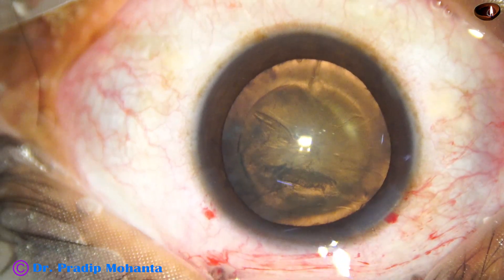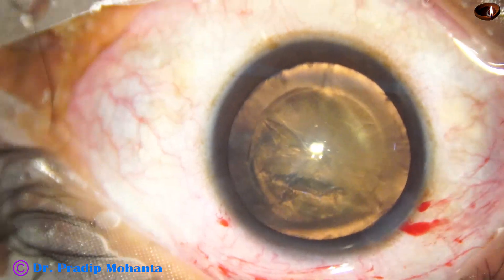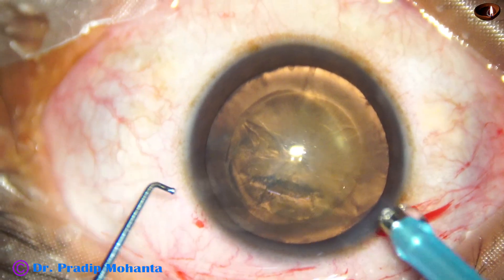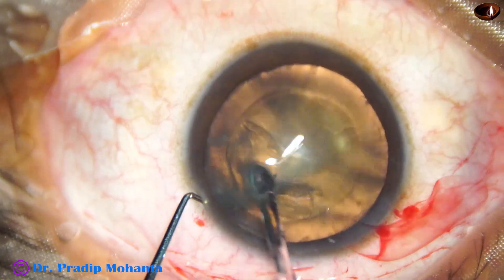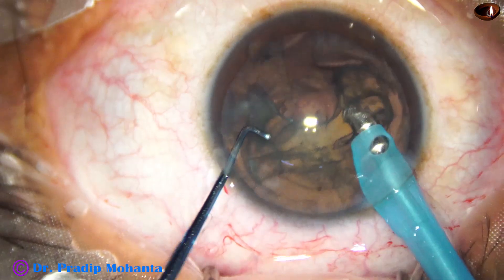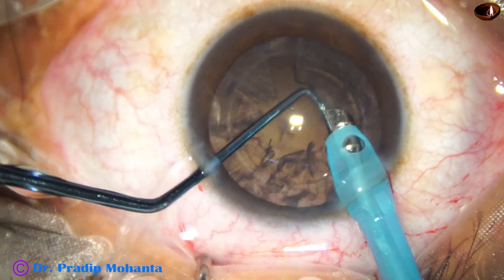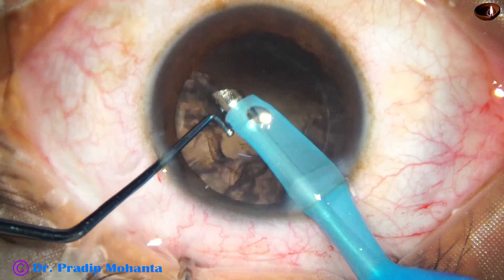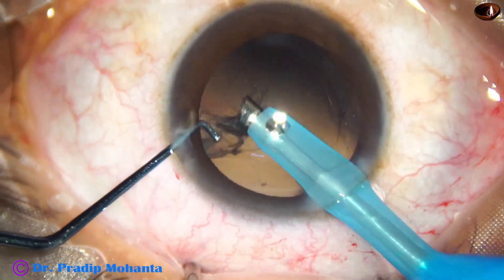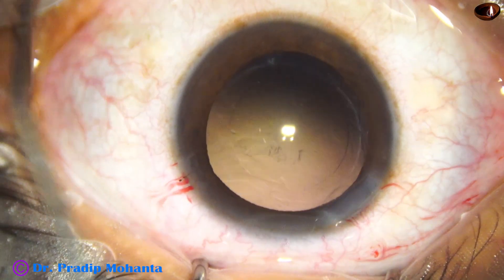Hydrodissection is done, and hydrodelineation is also done in this case. In such cases, when the patient is young and the nucleus is clear with only subcapsular opacity, facoaspiration is the technique of choice — no other technique is as efficient. You just keep the bevel down and apply high vacuum. The whole thing comes out of the capsular bag, gets aspirated, and you rotate the handpiece making the bevel sideways or bevel off towards the end. I am also removing most of the cortex with the handpiece itself — please do this at your own risk, as it has the risk of catching the posterior capsule. But once you know how to do it, it is a very quick technique.